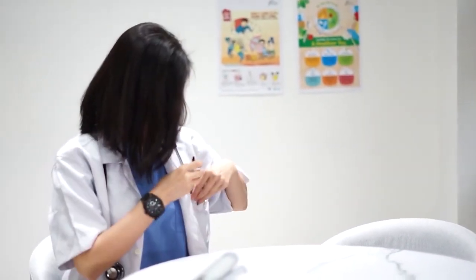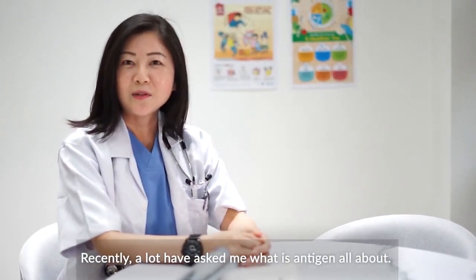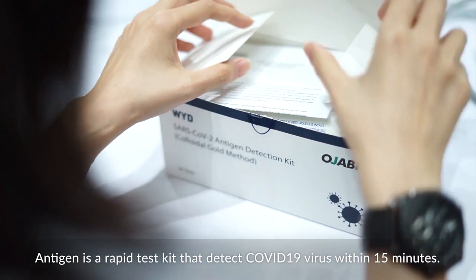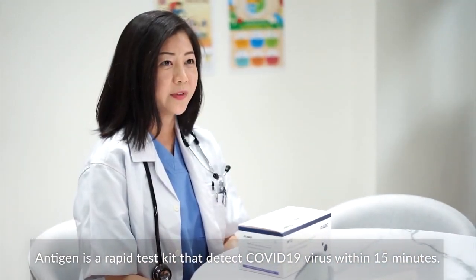Recently a lot of people have asked me what antigen is all about. Antigen is a rapid test kit that detects COVID-19 virus within 15 minutes.